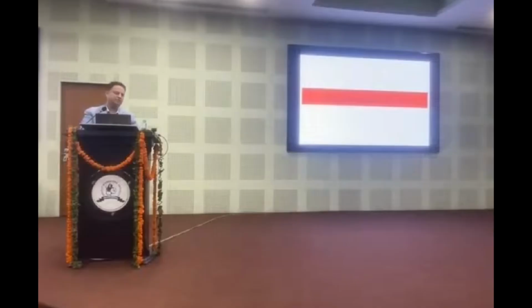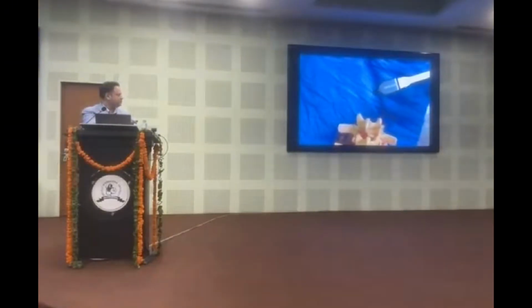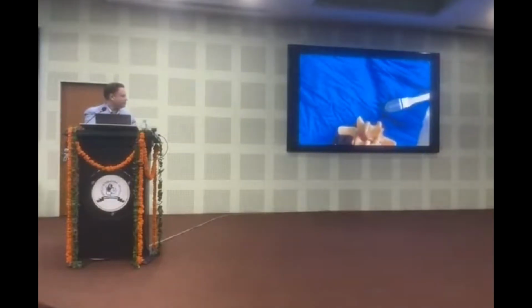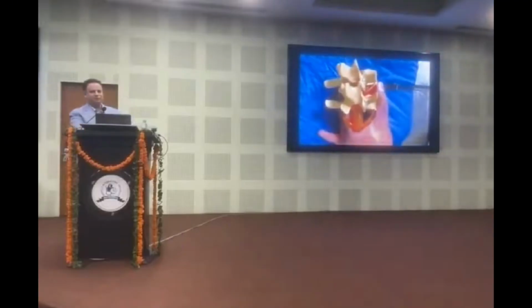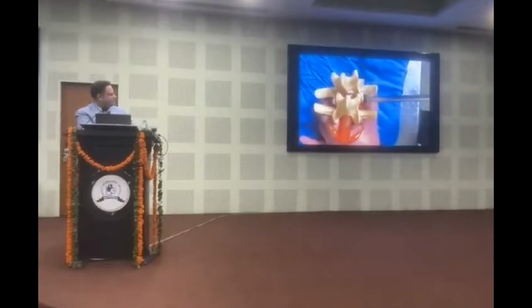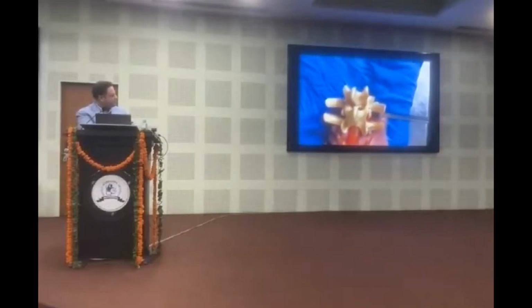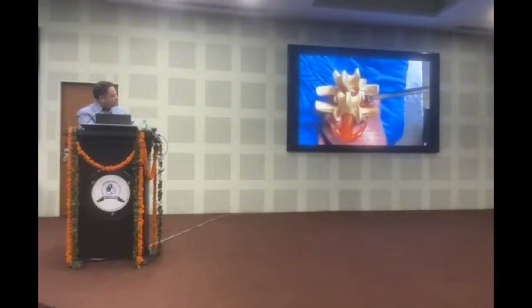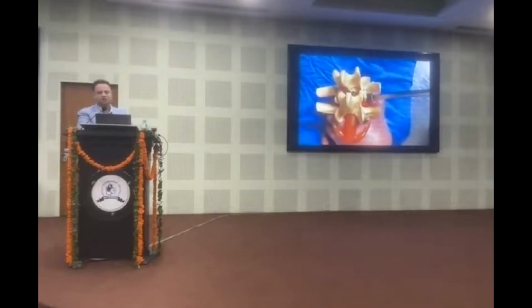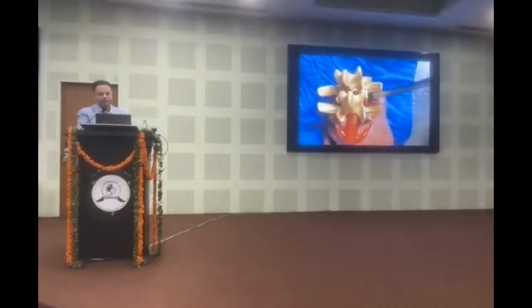Will you crush the exiting root? This is another question everybody keeps on asking. So I made a small video on the model, and you see the design of the cage is very important for this. So this is a 13 mm cage. This is the model. So even if I use a 16 mm, it doesn't matter. But you see, as the cage glides in, the tapered nose just pushes the exiting root away as it enters. So the design of the cage is really what makes this kind of surgery possible under local anesthesia.